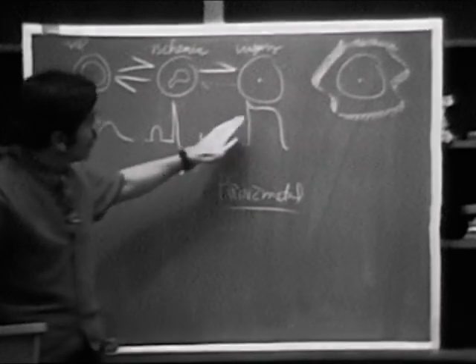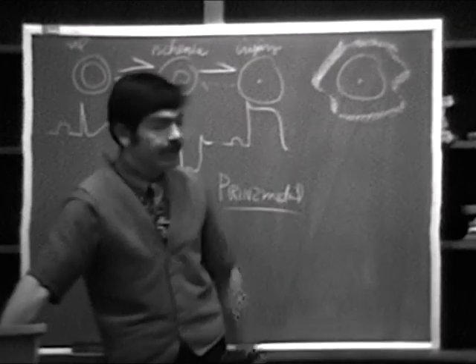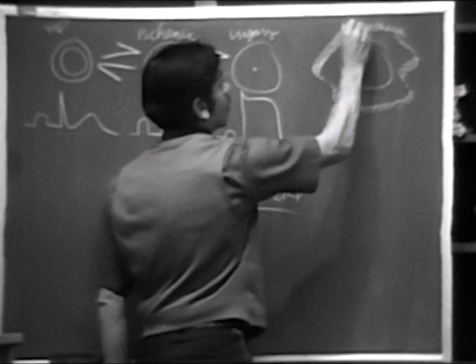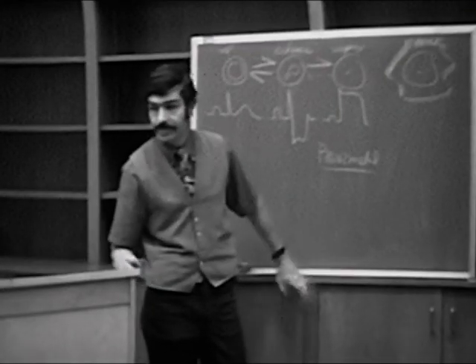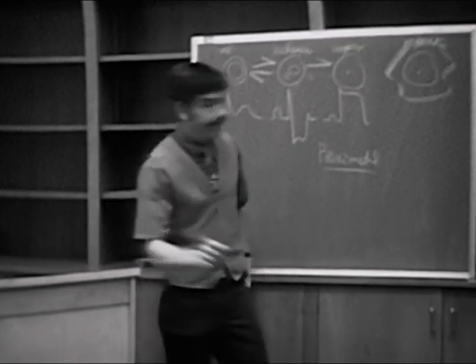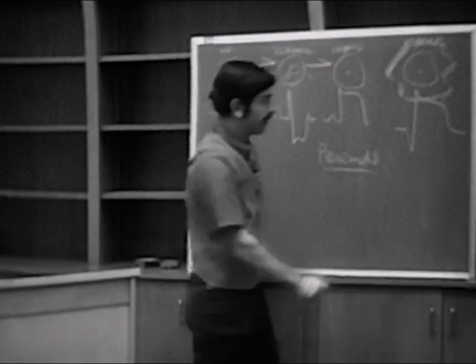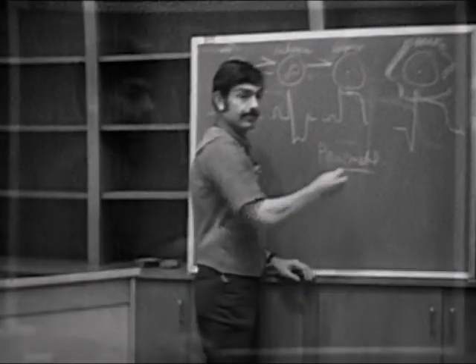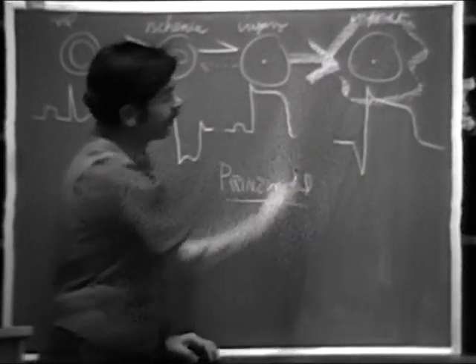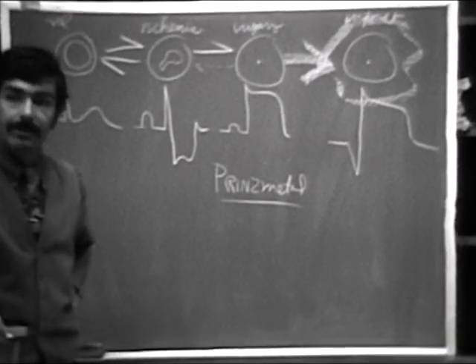All right, let's say this injury has persisted a while, and no blood has gotten through this vessel. Then eventually the muscle will infarct. And what do you develop in the EKG that indicates an infarction? You develop a Q wave. So the tracing looks exactly the same, except now you have a significant Q wave. That's the sequence of events. Is this reversible? No, once you reach that stage, it's not reversible. So this is the sequence of events leading to an infarction.